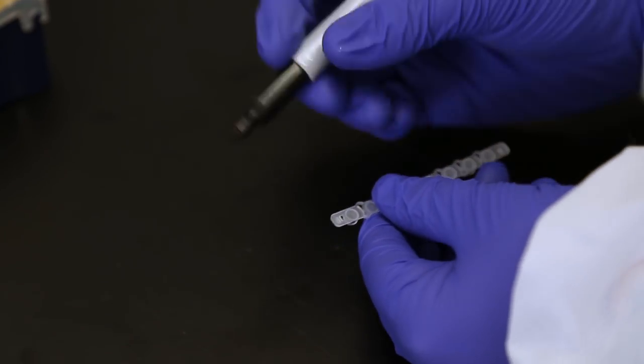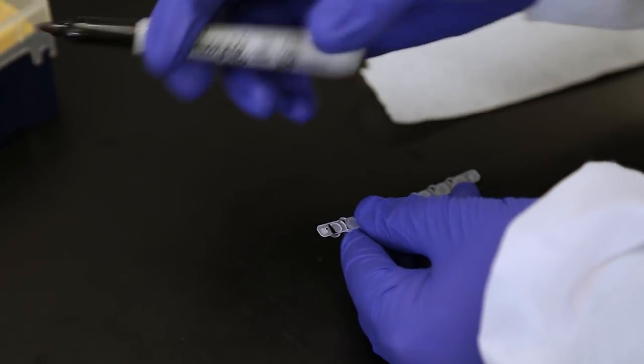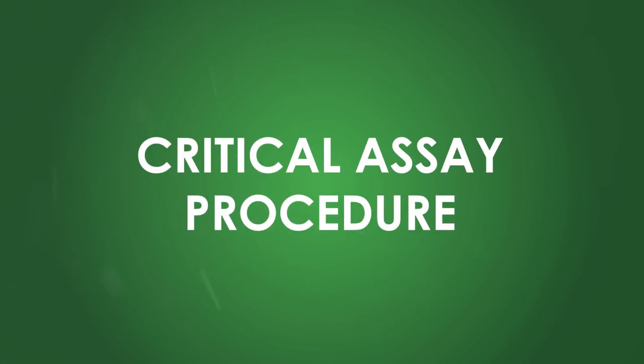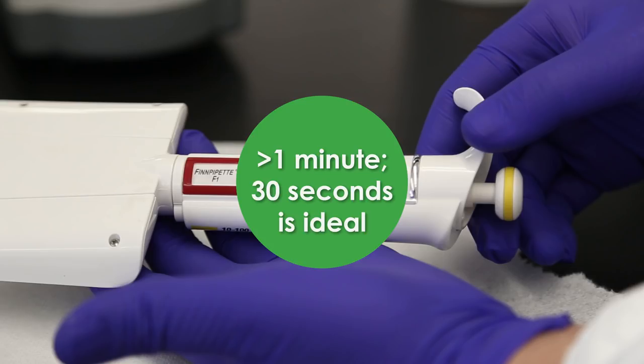To make sure you don't mix up the orientation of the tubes after vortexing, it's a good idea to mark the end that goes toward the first sample. Critical assay procedure. The next part of the procedure needs to be performed quickly in less than a minute and ideally within 30 seconds.